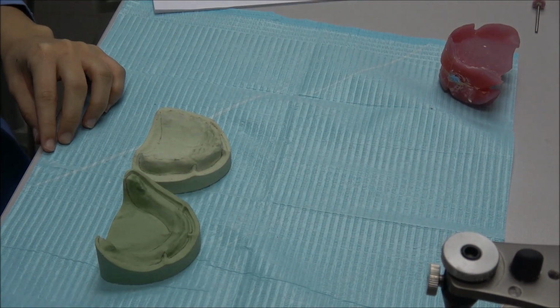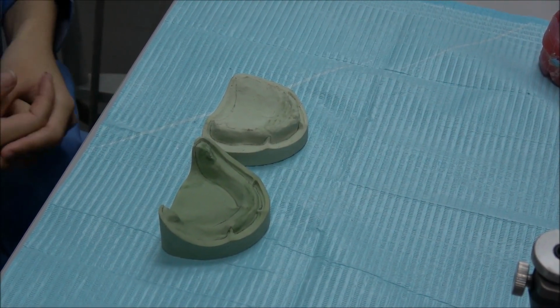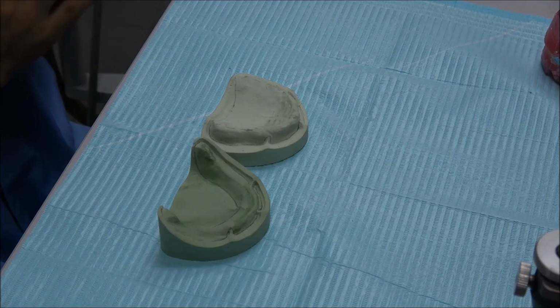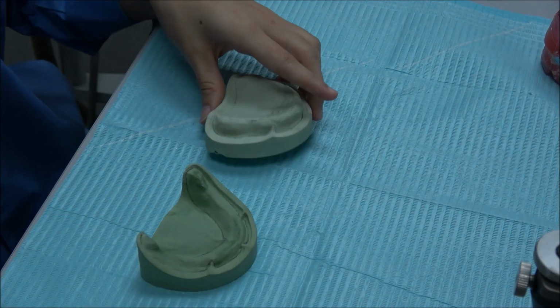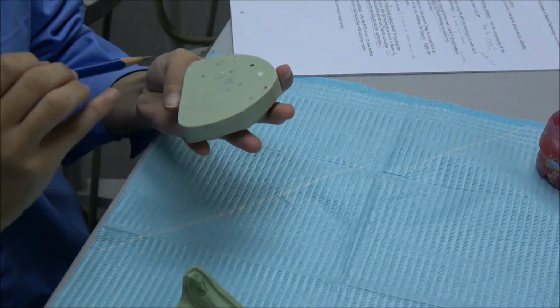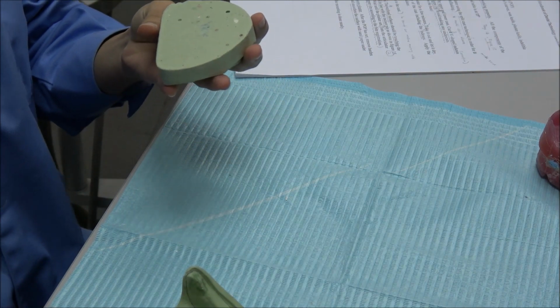After we check our articulator, we have to start now. For the mounting here, we are using the split cast technique. So we will make sure to place it back at the same position after flasking. For the split cast technique, we will put 3 notches here to lock it more, to make sure it has more retention. Later on, I will teach you how to do it.